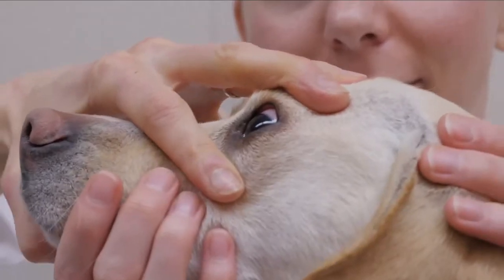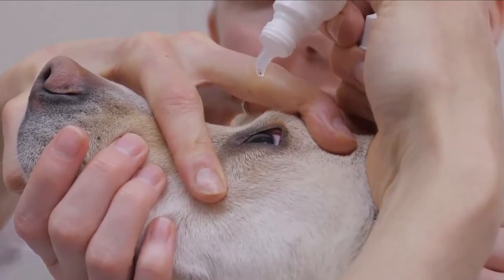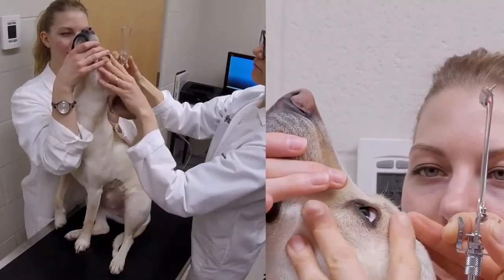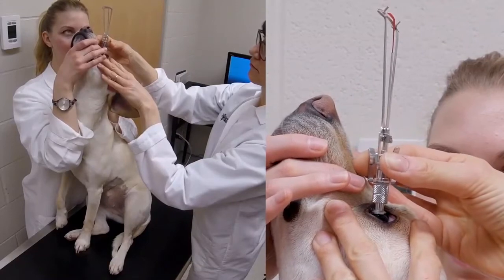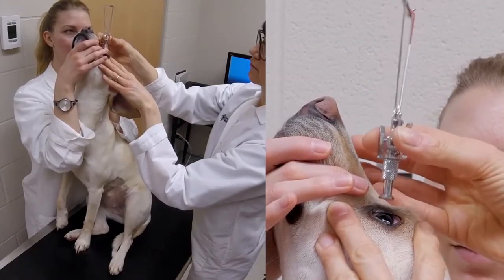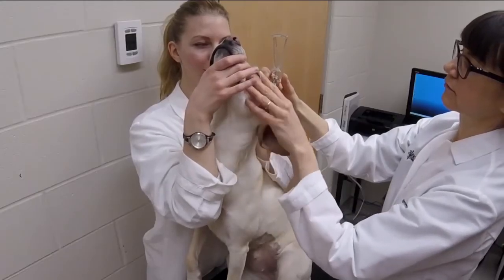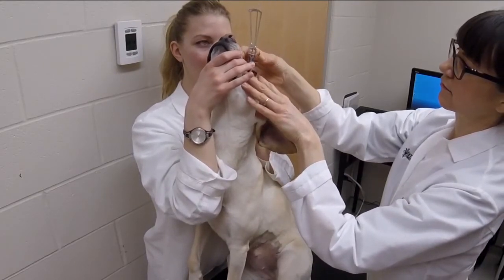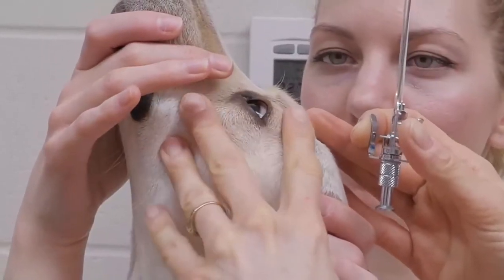Next, the patient's cornea should be anesthetized with 1 to 2 drops of topical anesthetic. After an approximately 30-second delay to ensure corneal anesthesia, the footplate is placed perpendicularly on the surface of the cornea. Because the plunger is gravity-driven, the tonometer must be positioned perpendicularly to the cornea to provide an accurate reading. Therefore, proper head position to allow the cornea to be in a horizontal plane is essential for obtaining an accurate intraocular pressure estimation with the Schiotz tonometer.